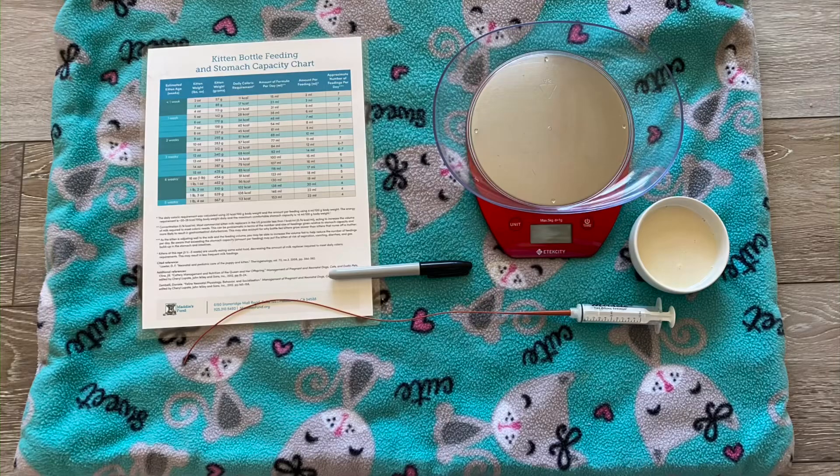Here are the supplies that you are going to need. You'll need a scale, a stomach capacity chart for kittens — I use the one by Maddie's Fund — a permanent marker, your milk replacer which is at a warm but not hot temperature, a syringe, and the feeding tube.